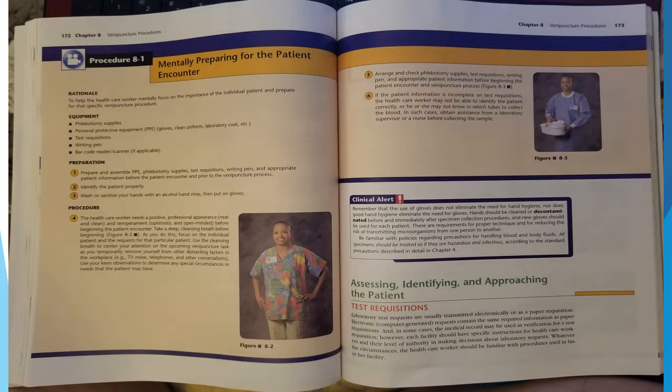Page 172 shows Procedure 8.1, mentally preparing for the patient encounter. Rationale. To help the healthcare worker mentally focus on the importance of the individual patient and prepare for that specific venipuncture procedure. Equipment: phlebotomy supplies, personal protective, or PPE, equipment such as gloves, clean uniform, laboratory coat, etc., test requisitions, writing pens, and a barcode reader scanner if needed.